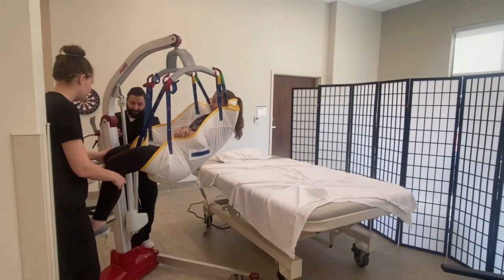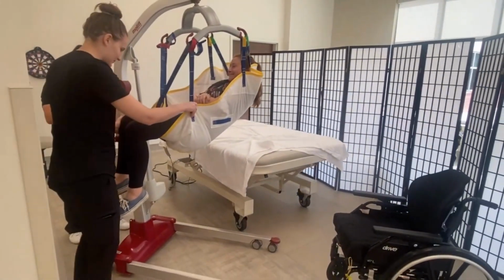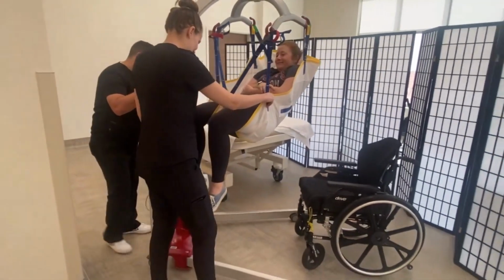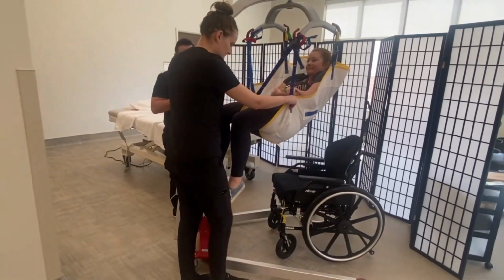When using a lift, always have at least 2 people present, one to monitor the lift and another to monitor the patient. Also, always check the weight limitations of both the sling and the lift prior to use.